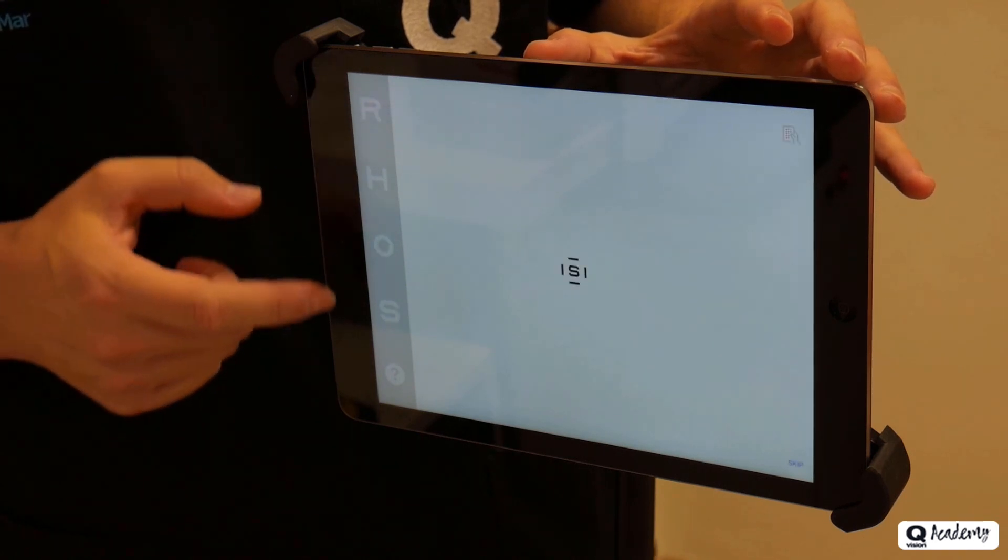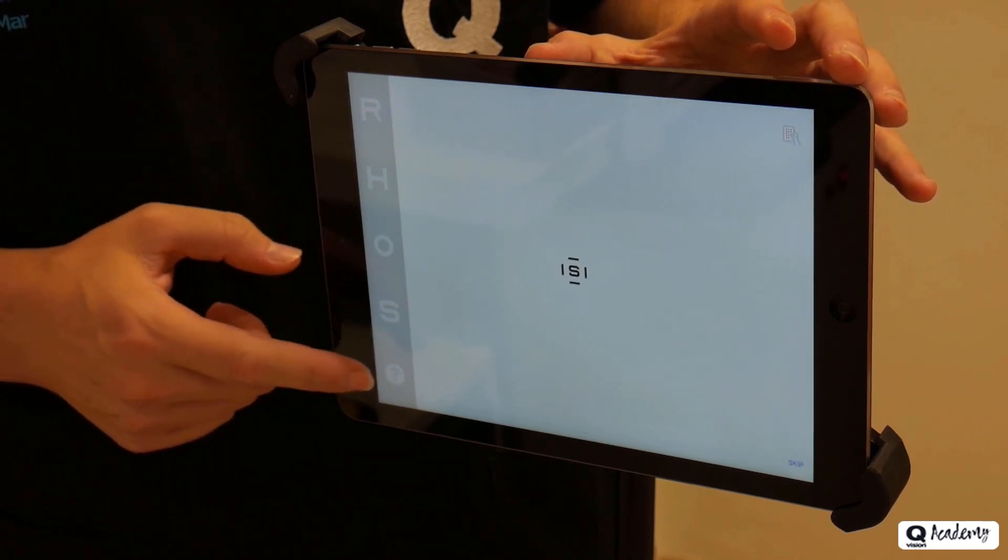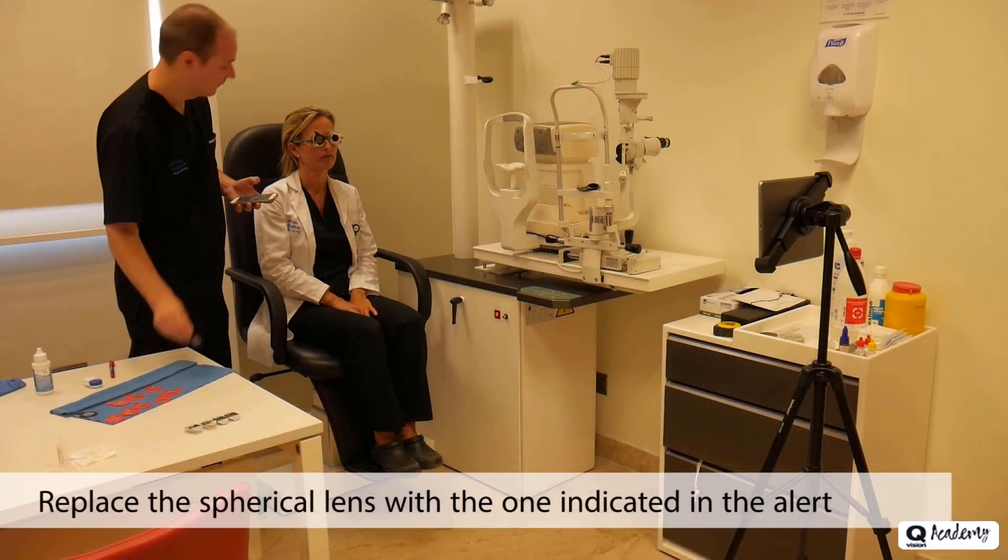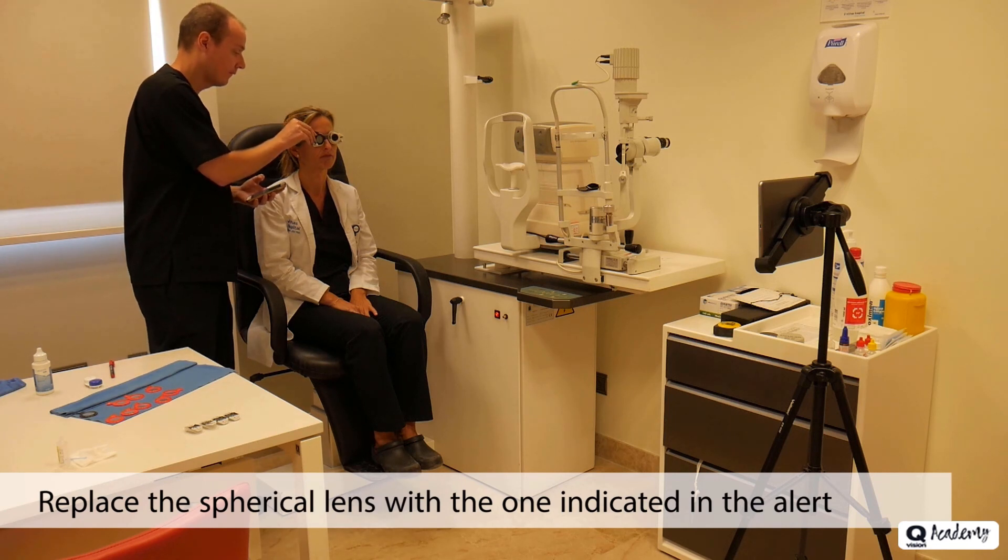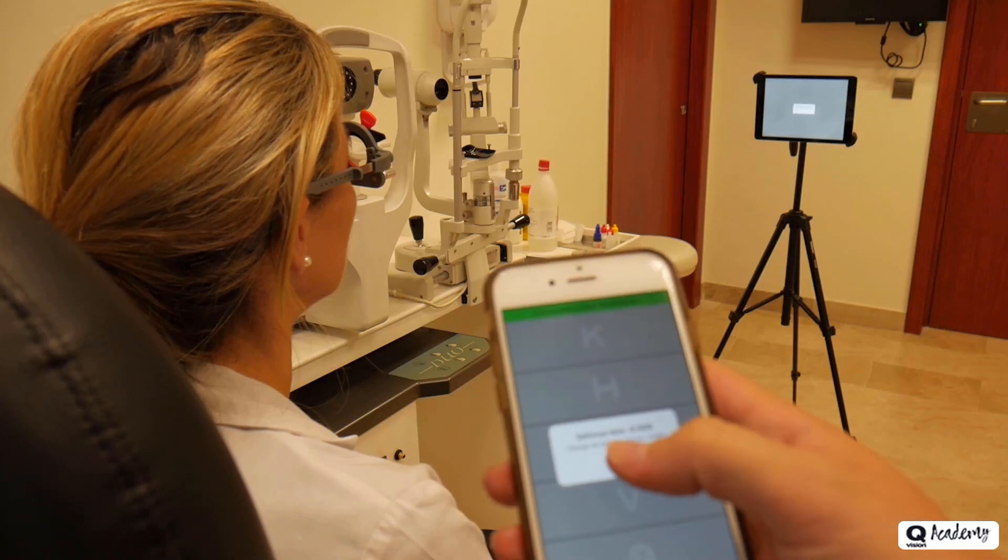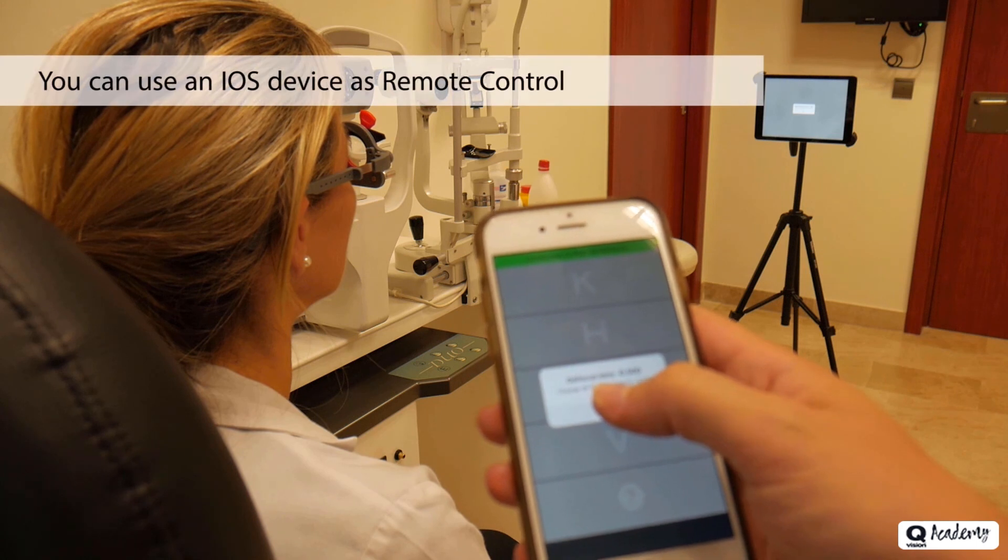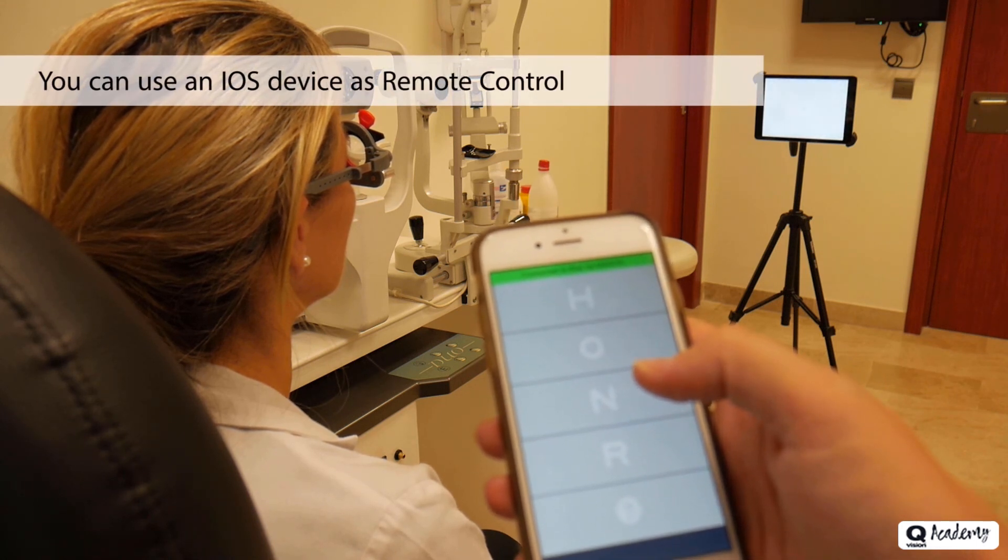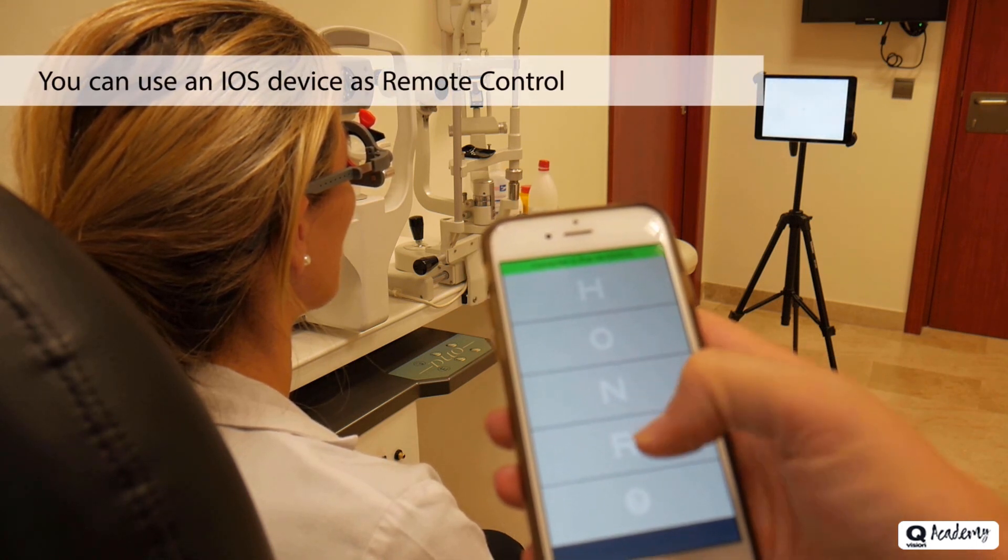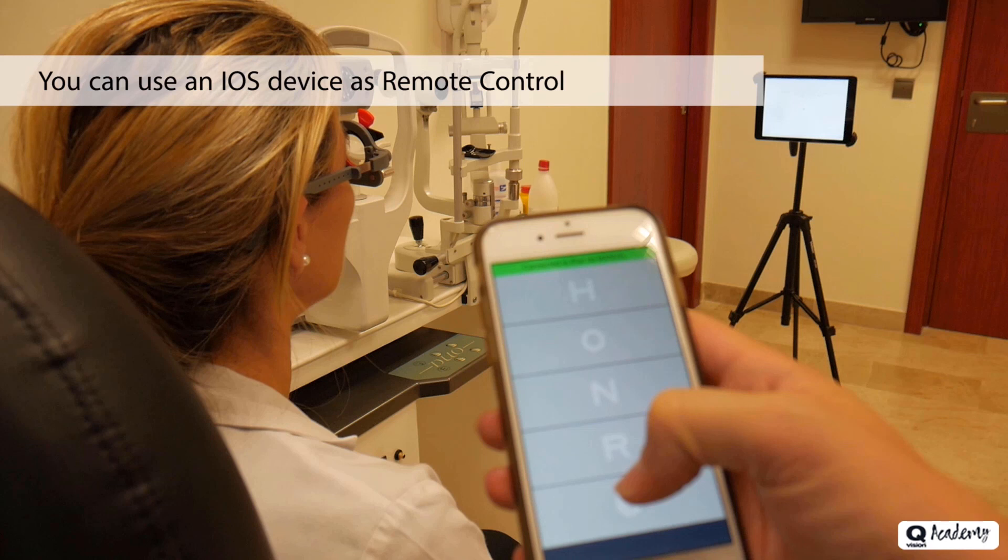The defocus curves, although the application reduces the measurement time to about 7 to 8 minutes, are a procedure that can be tiring for the patient. We recommend at all times during the test to maintain communication with the patient, encouraging him or her to read the next letter, and not to spend too much time trying to recognize it. If the patient hesitates to answer, we must make them understand that this is a normal process, as we are intentionally exceeding the limit of their vision.